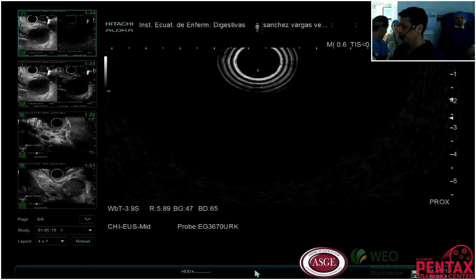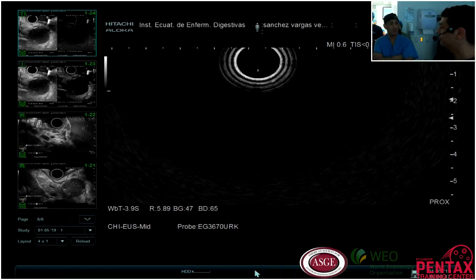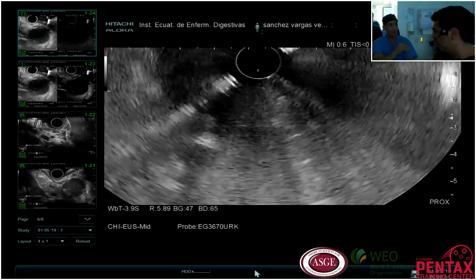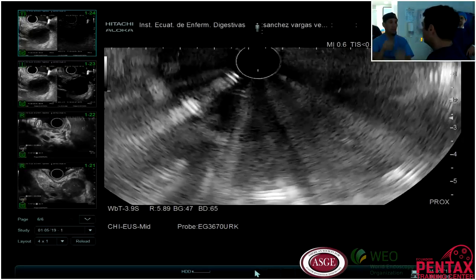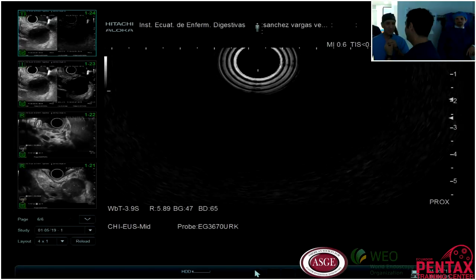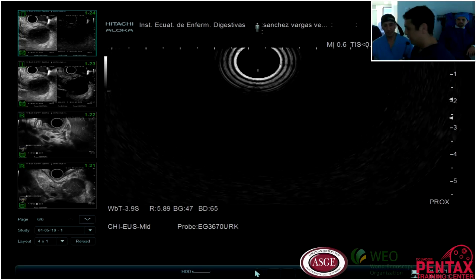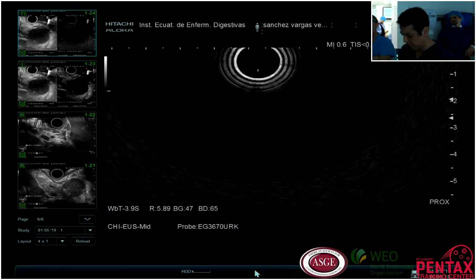Very nice. So the analysis is powerful. I never knew we could do that. Before, it was a criticism that it's subjective. Now, this new ability will give us objective evidence. Totally agree. This is a big difference regarding the technology and how we can deal with this.